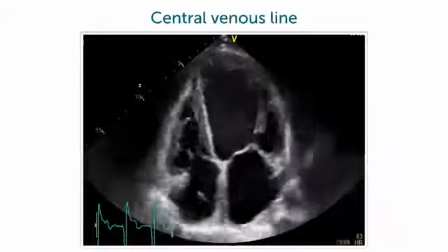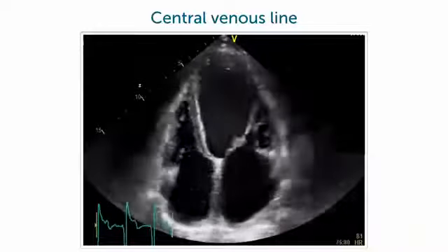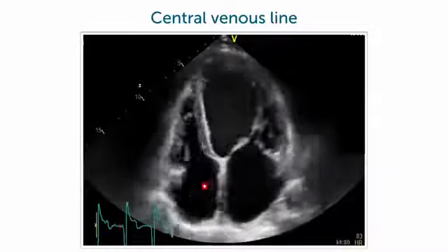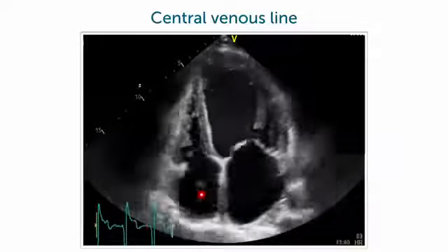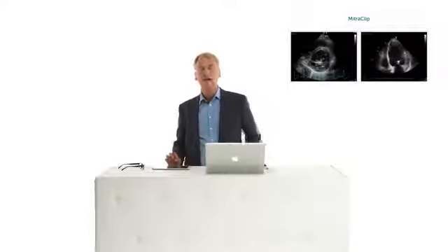And finally, patients who have a central line, especially if it's placed too deep into the heart, can also sometimes present as if they have a pseudotumor. Here is an example of this central line, which is almost touching the tricuspid valve, or at least it's very far inside the right atrium. So be aware that especially dialysis patients have central lines and dialysis catheters that you might be able to see with echocardiography. And finally, this is a so-called mitral clip.